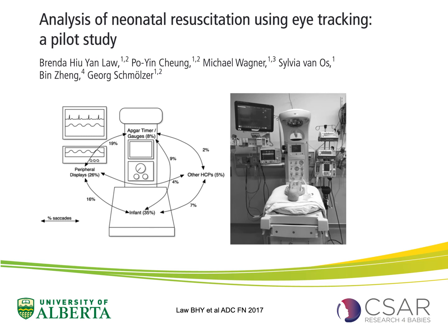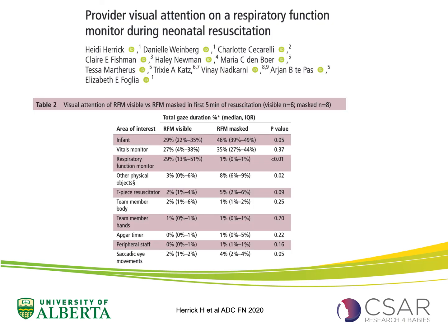As you can see, only 35% of the time do healthcare professionals at the head of the table look at the baby. The other times they look at all the monitors. And again, from one of these randomized controlled trials, where they also added eye tracking glasses in the delivery room, what was quite striking was that when they had a respiratory monitor visible, the percentage of the time people looked at the infant was only 29%. When they didn't have an RFM, it was 46%.